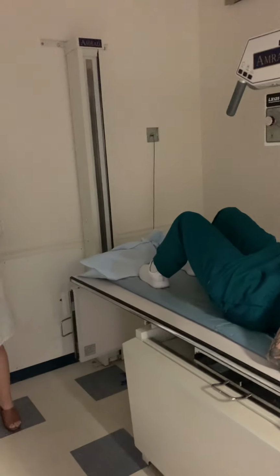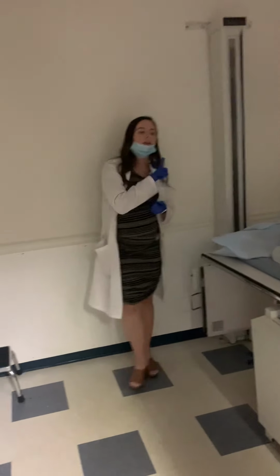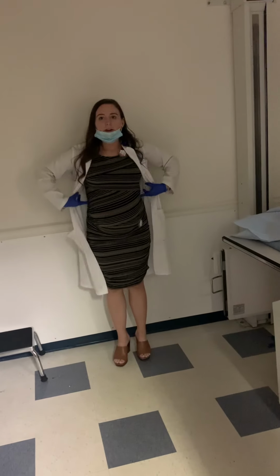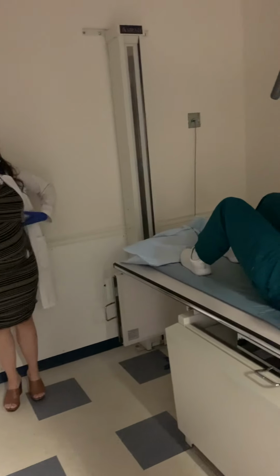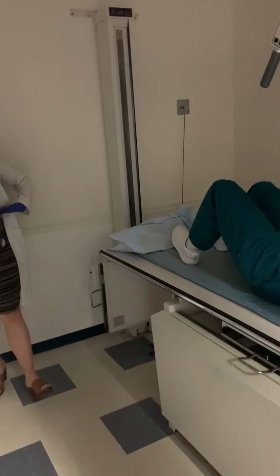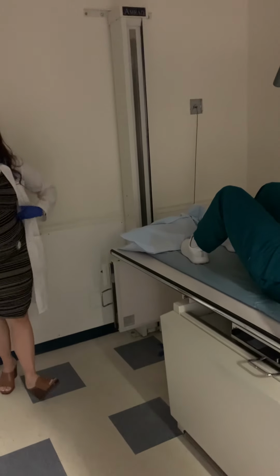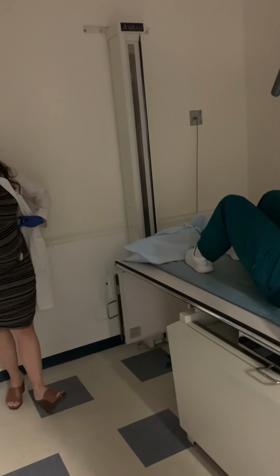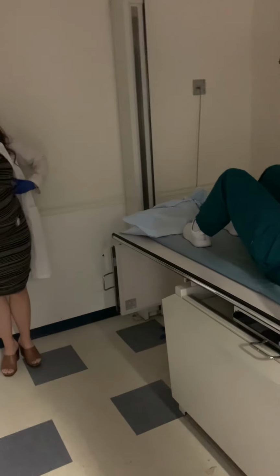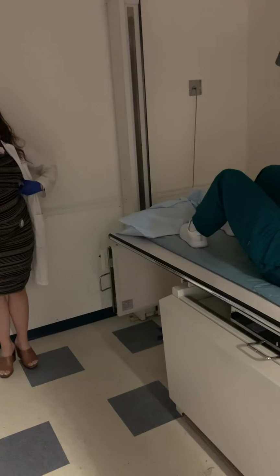So that's pretty close. So we have one that's a little closer, and it's called the inferior rib margin. So if you feel laterally, it's the last rib that you can actually feel on the patient. So this is about the level of L2 or L3 when you feel this. So this is going to be our landmark for these. So you're going to find the inferior rib margin. If that is L2 or L3, you're just going to go up about 1 inch.